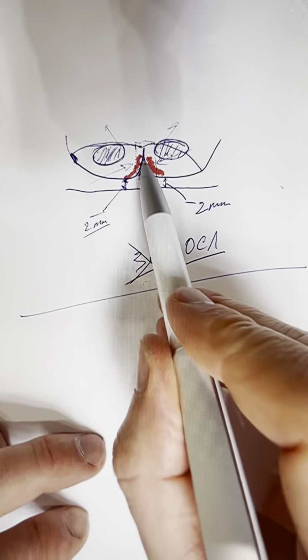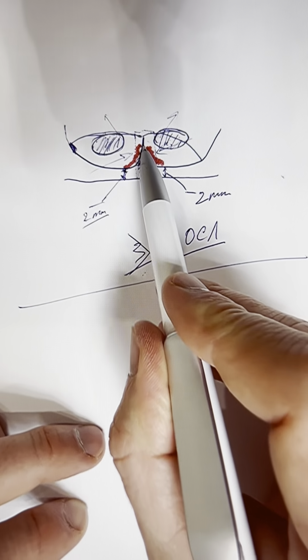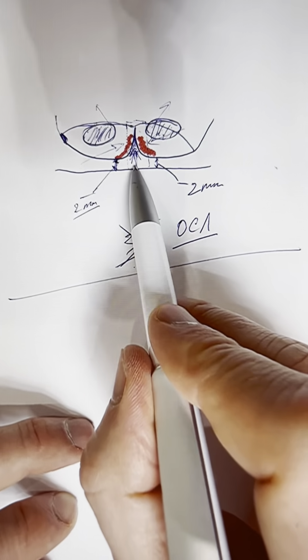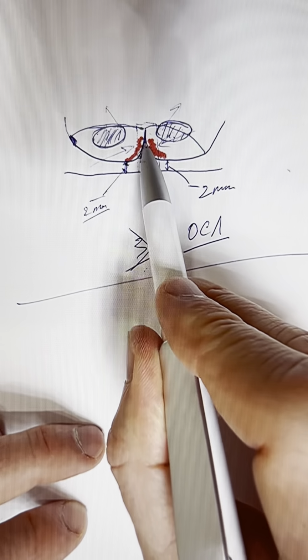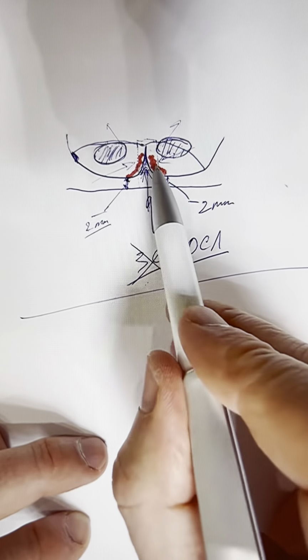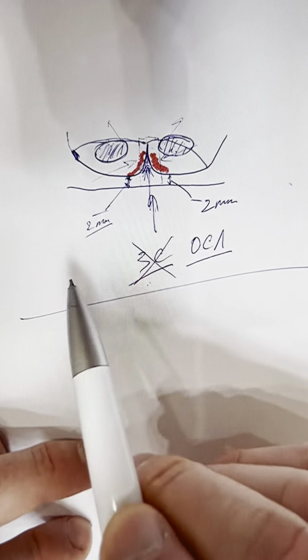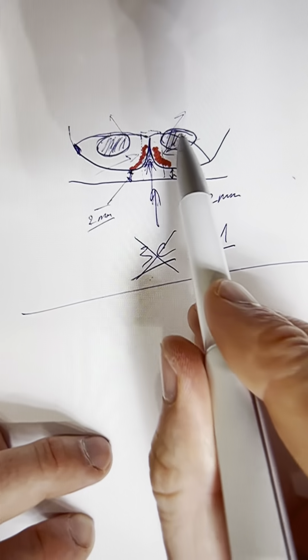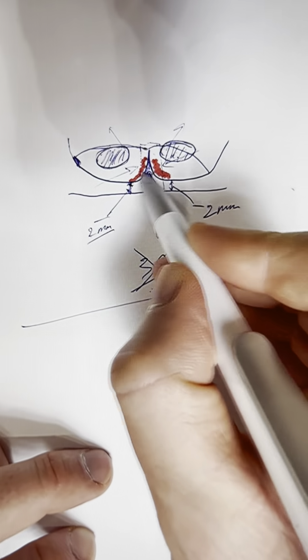And the presence of the septa on one side attracts you to place an implant in this septa, but you should always remember that when working with a drill in this septa area, you will have the deceptive impression that you are completely in the bone tissue. So the drill will damage the Schneiderian membrane with its movement, and you will perforate it here. It will be unfavorable. In such cases, you will need to have access for the lateral open sinus lift, and during the surgery, you will need to cut down this septa.